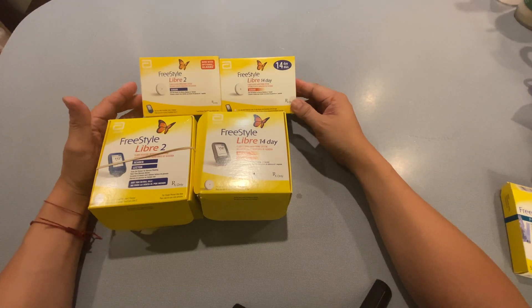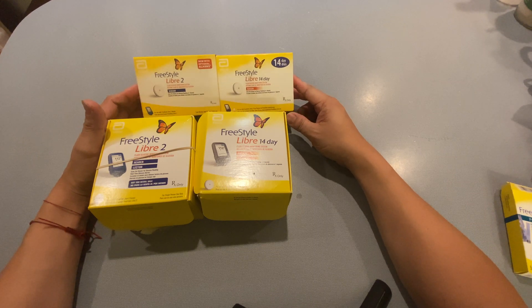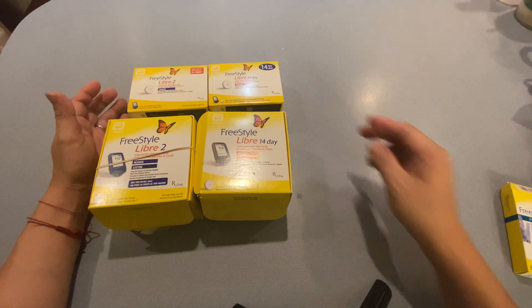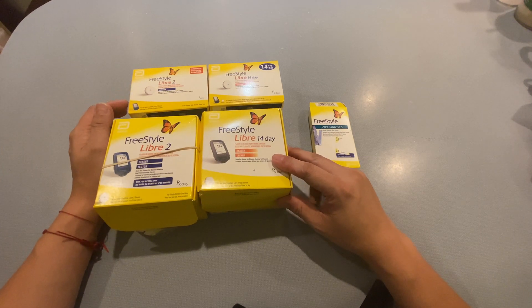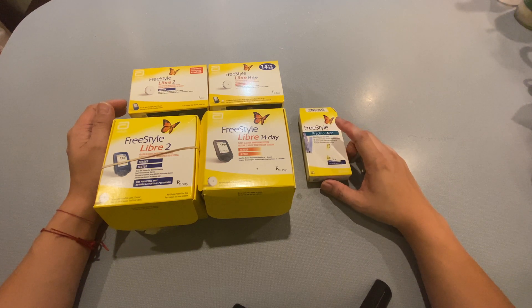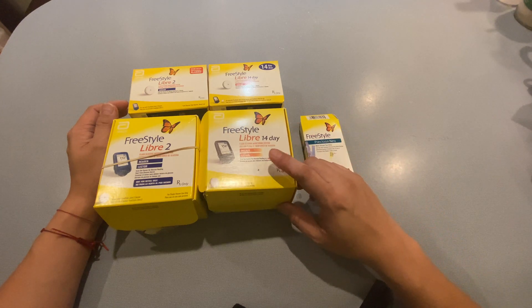I have the CGM sensors as well — they are both 14-day sensors. We'll go through the pros and cons of those as well as the test strips. While these are continuous glucose monitoring systems, they are also built in with blood glucose testing capabilities, so you don't need a separate blood glucose monitor. It's built into the actual reader itself.